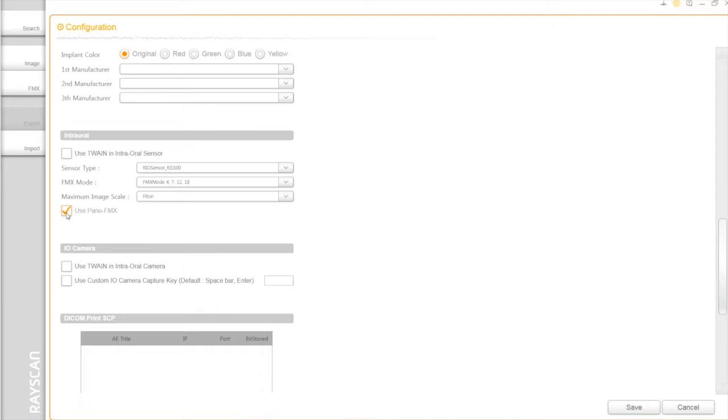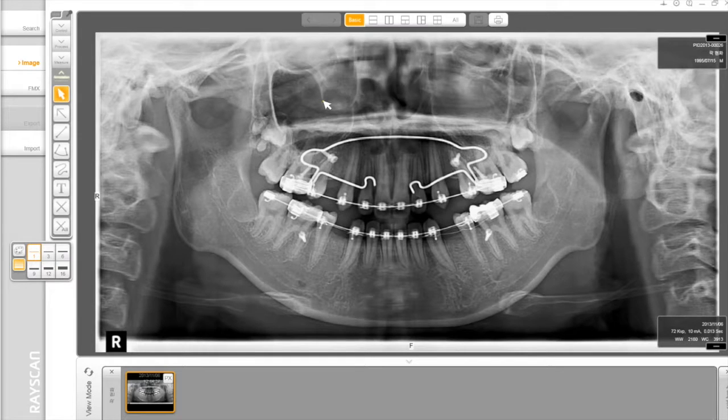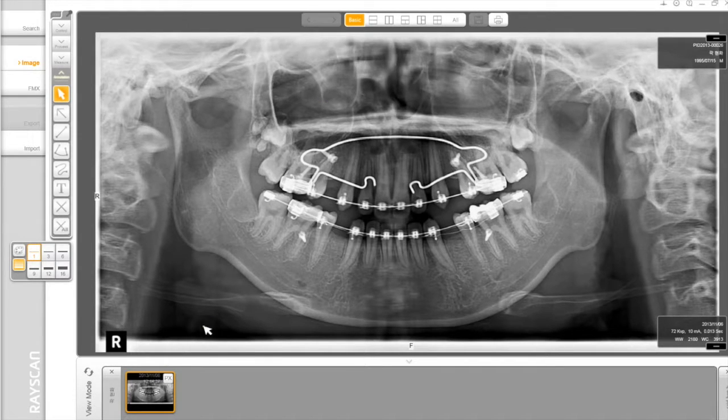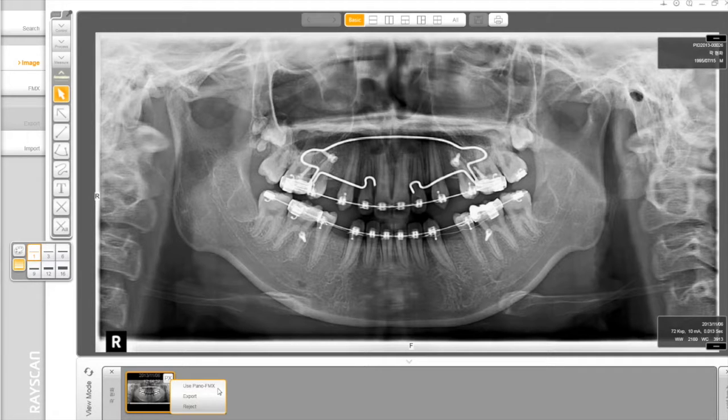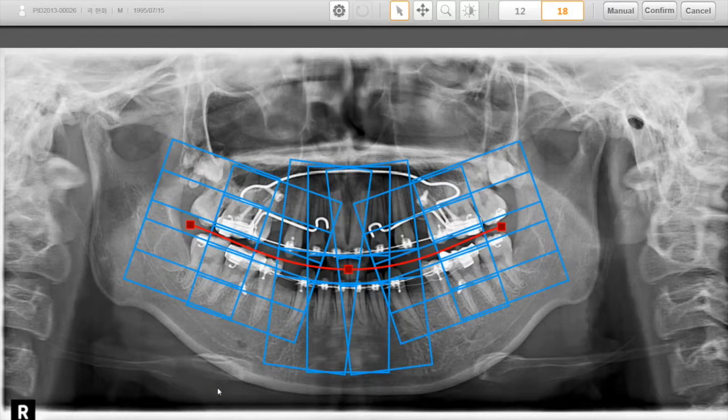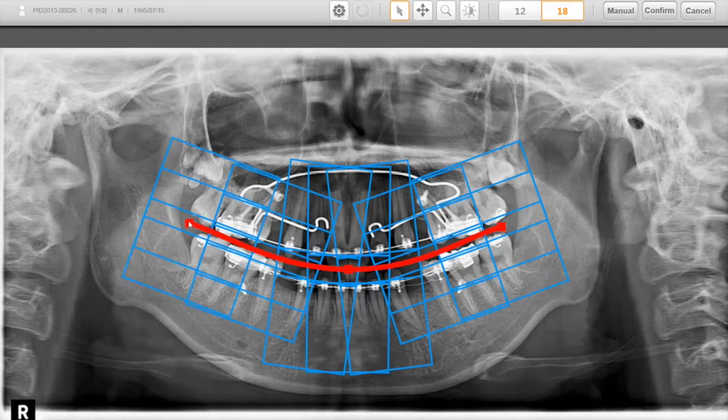By using Pano FMX, you can extract intraoral images out of normal panoramic images. Click the small px button on the layout and then select Use Pano FMX. You will have another interface as shown.